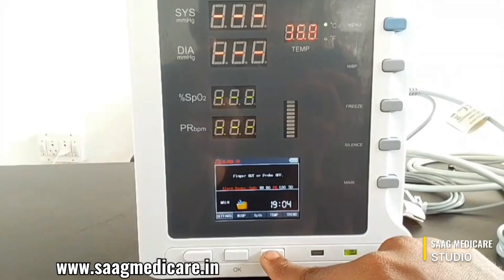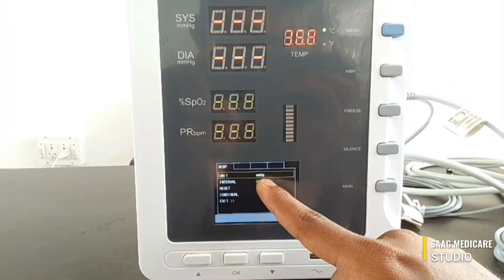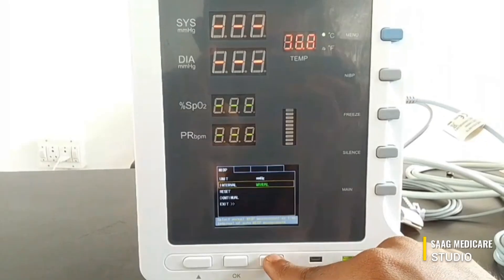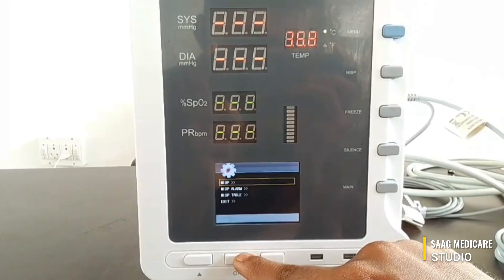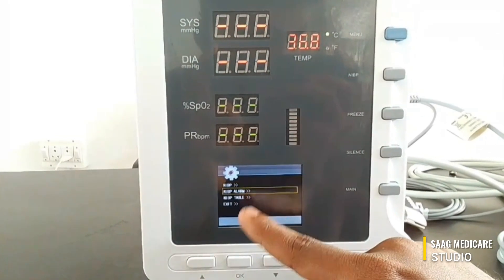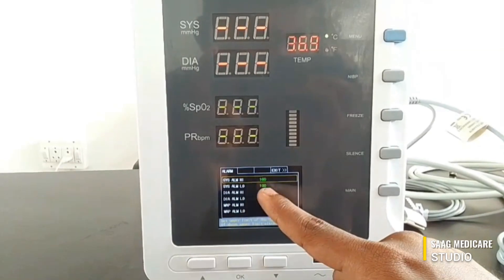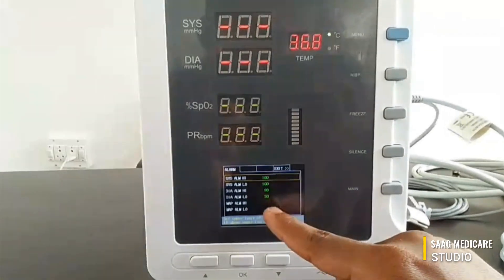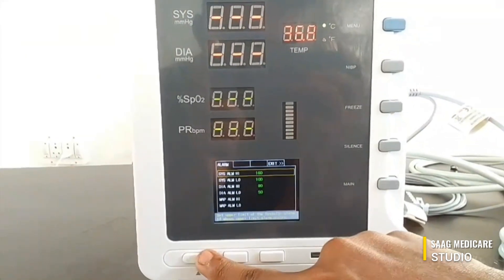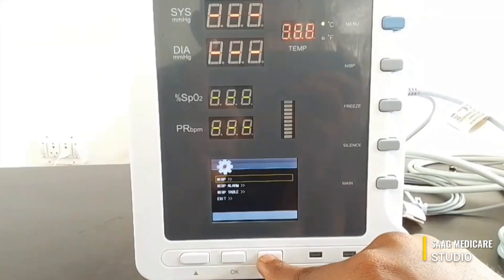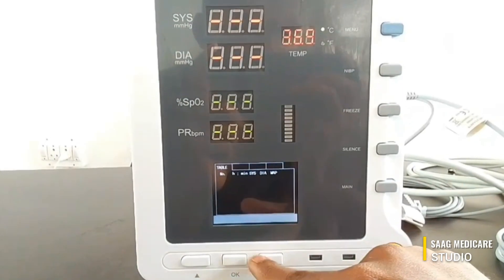We can move on to NIBP settings. In NIBP we can set up the NIBP unit, interval, or we can reset and exit. In NIBP alarm settings we can change the systolic alarm high and low, and diastolic alarm high and low.